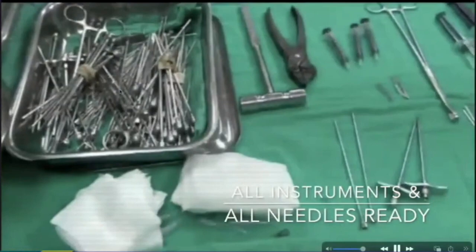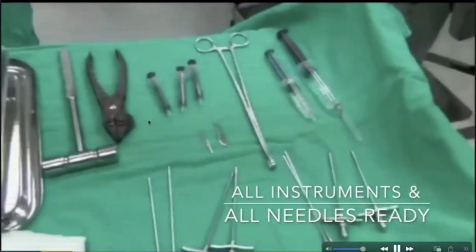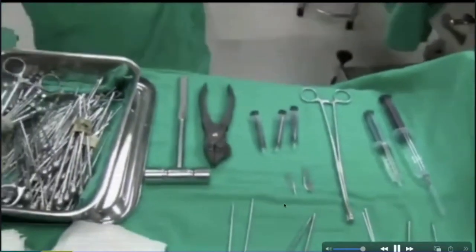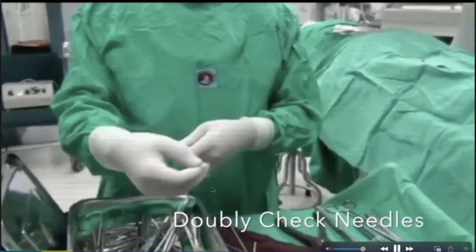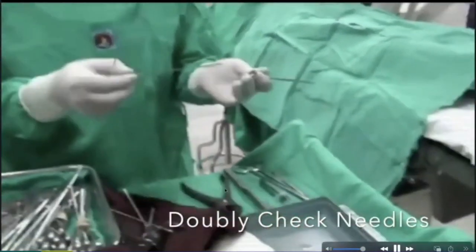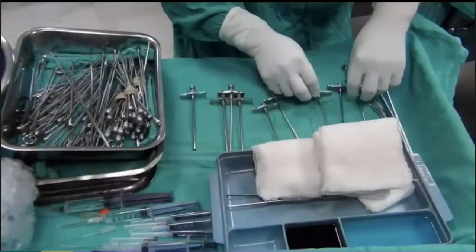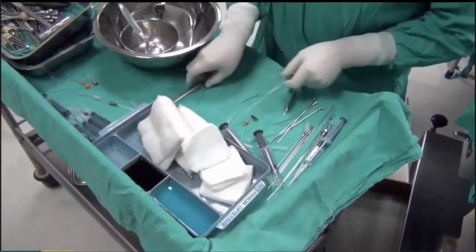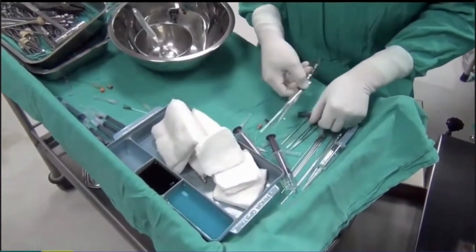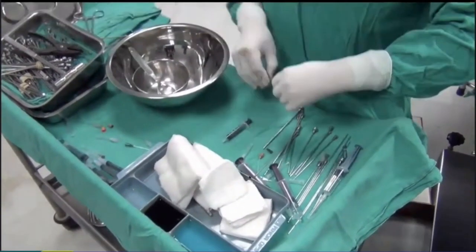Have n number of needles, n number of trocars, the dye and LA, pliers and hammers, everything you will need down the line. Check that your needles are clear, and practice how to clear them and the stylets. Keep different size needles, like 7, 8, 9, 10, 11, 12, 13, depending on the pedicle size, where the fracture is, how much cement is to be filled, the morphology of the fracture, which level the fracture is, and your expertise. You can use different needles.